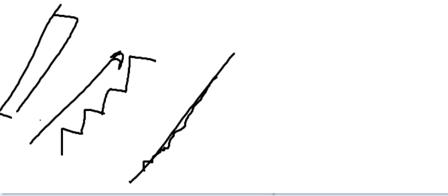So the smaller the detector, the higher the resolution. If the detector is smaller, resolution is higher, the ability to make thin slices is greater, and the reconstruction is better. Get it? Any questions? Noise does not affect the resolution, so there is no correlation between noise and resolution. Noise does not affect the resolution, but makes the image more granular, more grainy, dirty looking. Okay?